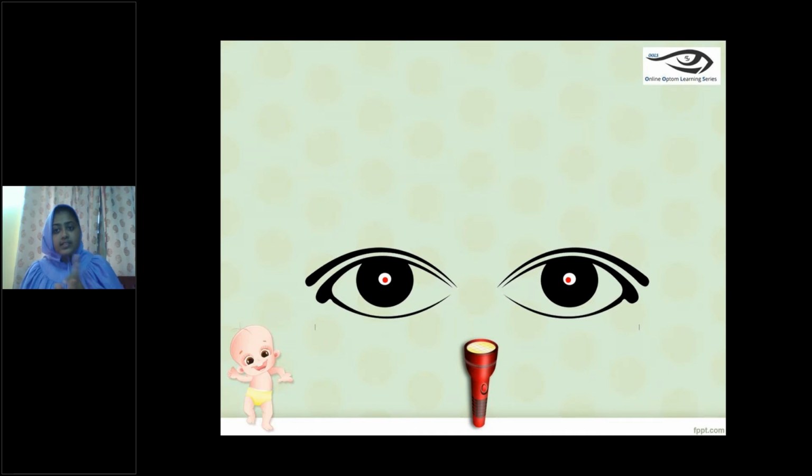So if the child has a nystagmus, then we will write central, unsteady, maintained or unmaintained depending on how the eye is taking fixation. Suppose the child is not immediately taking fixation but blinks and then takes fixation, then we have to write central, steady, unmaintained, maintains fixation after blink. So that is how the documentation of the CSM method would be.